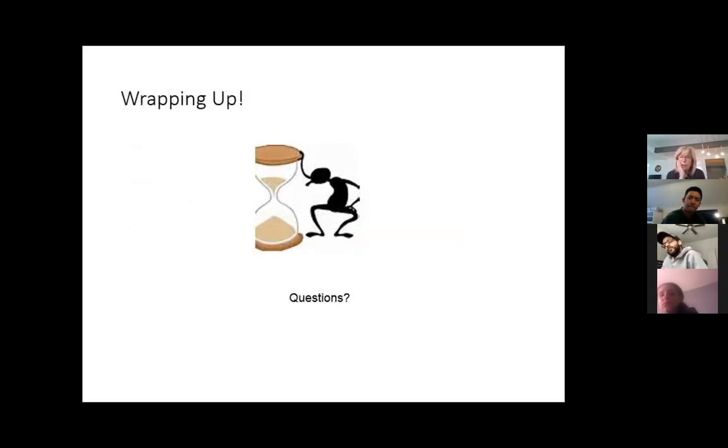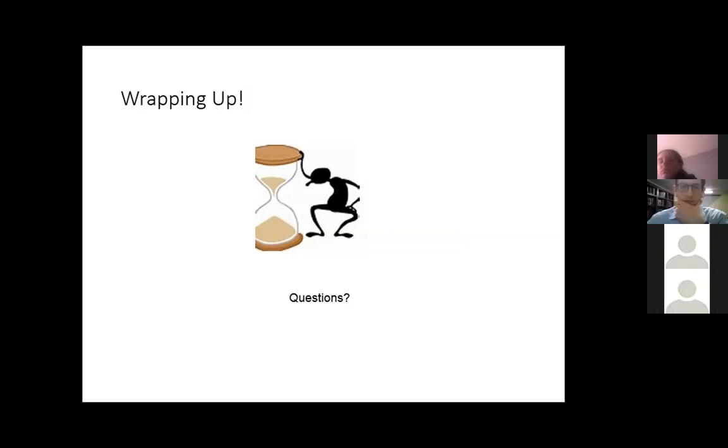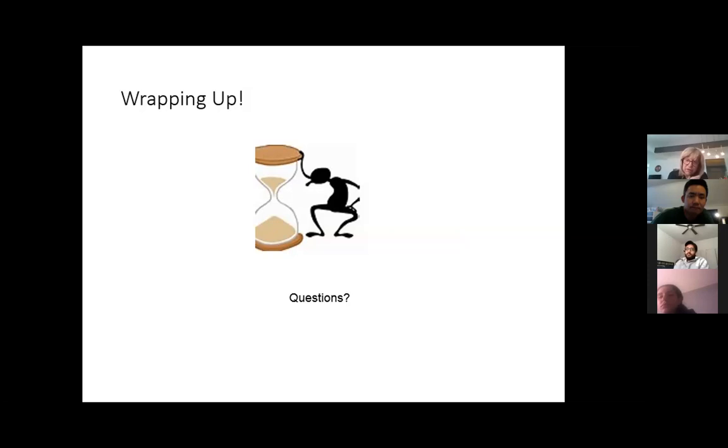Anyway, more than you wanted to know, but I think that will get you through your boards and will help you with your pattern recognition. And I think the times are changing, and this whole thing's going to change to consumer wearables in the next 5 years. Because you know how much they charge for those actigraphs? $900, $750. You don't get reimbursed.